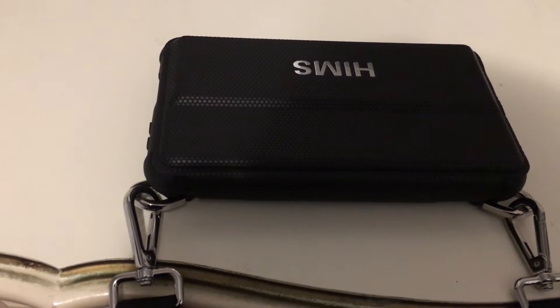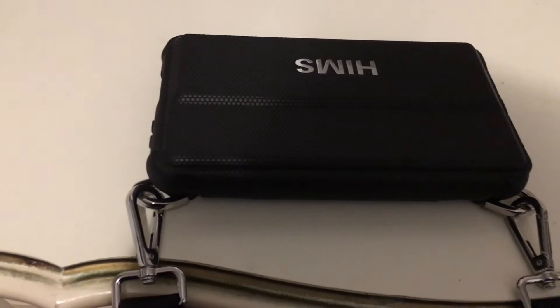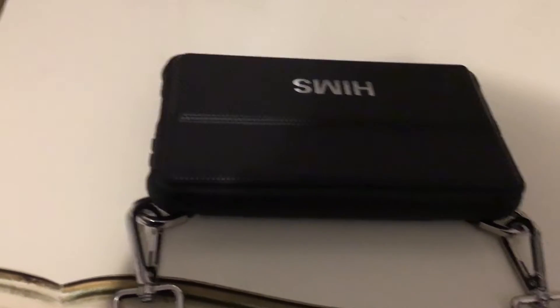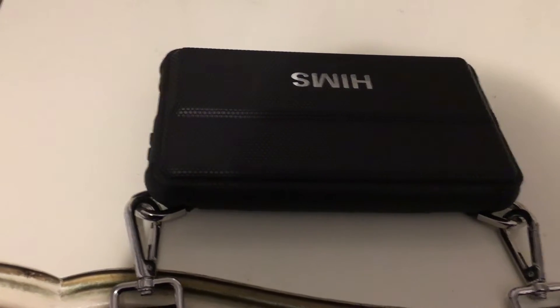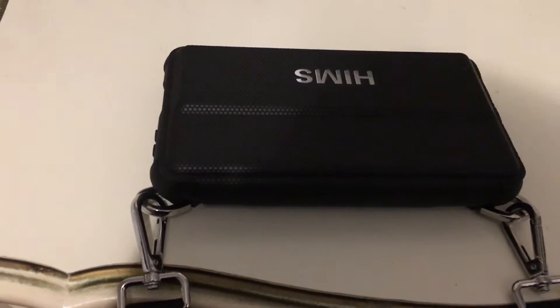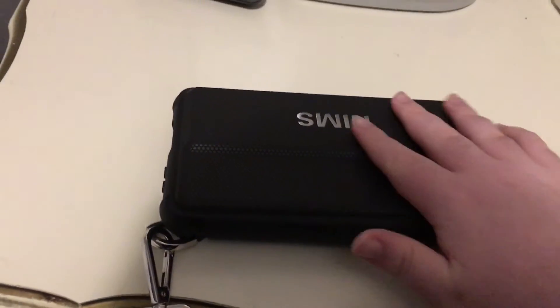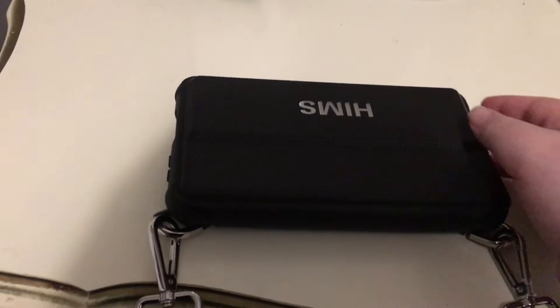As we know, HumanWare in 2016 came out with the BrailleNote Touch, which brought Android to the BrailleNote. Well, Hims did the same thing but took a bit of a different approach, and I was fortunate enough to get my hands on a Polaris Mini.